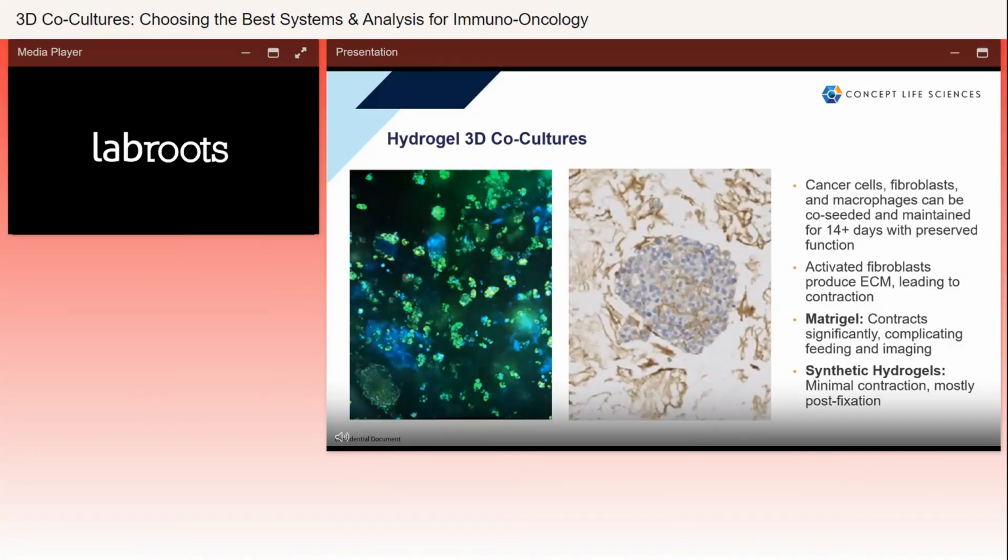And then on the right here, we have a much more detailed focus. We've taken a histological examination of some of these spheres, and you can see how the spheres look. This is a DAB stain for collagen, and you can see the collagen all the way through to the centre of the sphere. There does seem to be some background with the PeptiMatrix on the outside, but within the sphere you can see these collagen fibrils.